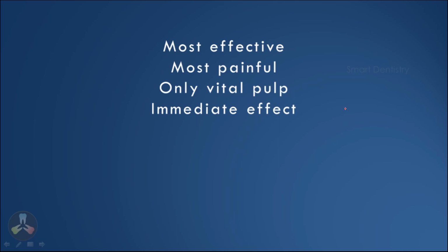Intrapulpal anesthesia can be considered the most effective anesthetic technique while doing root canal treatment, because it will work instantaneously, and we can feel the anesthesia within seconds. The next second we can prepare the access and proceed with our root canal treatment. There will be no pain at all. But while giving it, for a second or two, there will be a severe pain for the patient. So without informing the patient about this painful sensation, never give intrapulpal anesthesia.